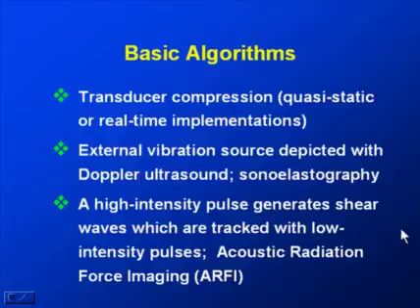The third general class of algorithms is referred to as acoustic radiation force imaging, or ARFI. And here we use a high intensity pulse, but high intensity means still within the diagnostic range. This is a pulse equivalent to what you used in color Doppler. But this pulse is sent into the tissue, and by doing that it generates a shear pressure, which in turn will generate shear waves that will travel out laterally from the transmission direction.